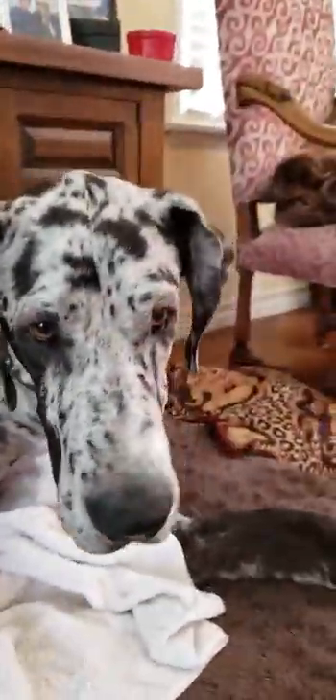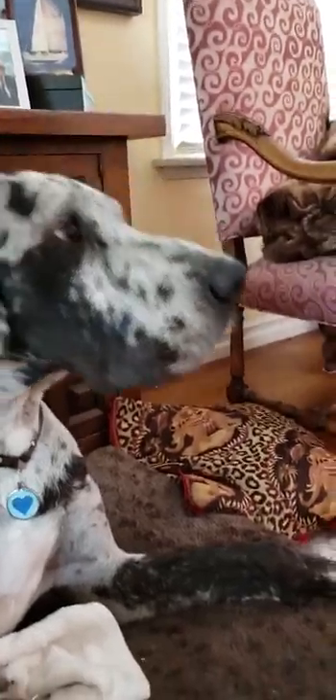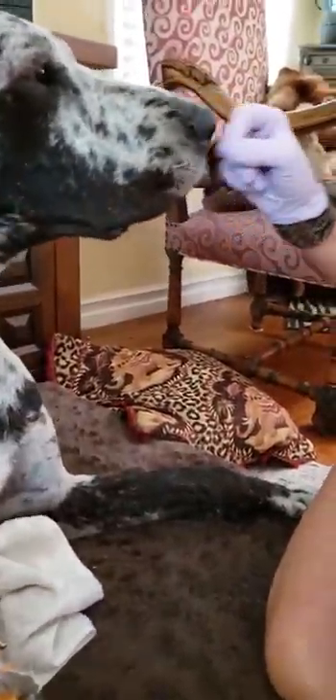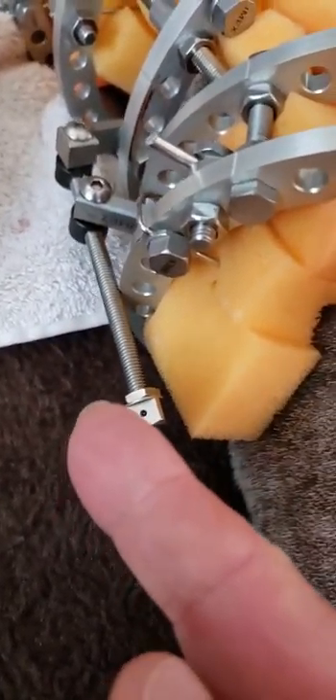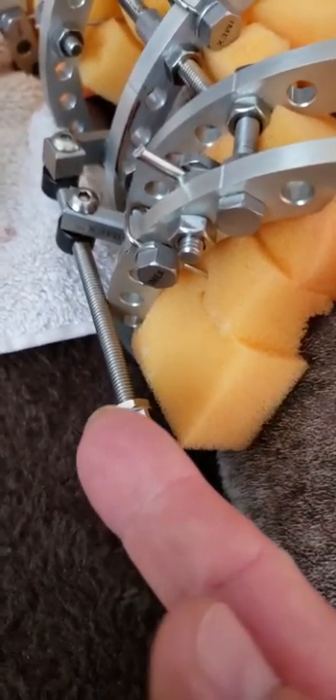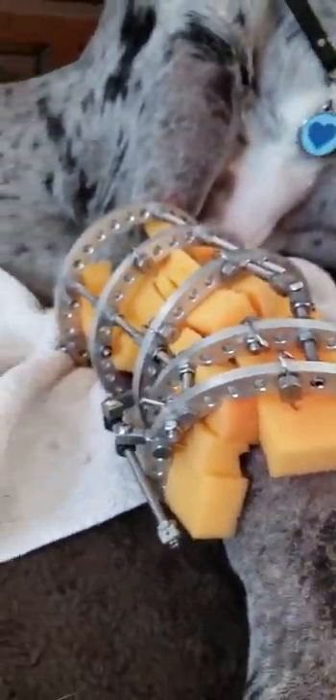This adjuster screw — careful, big boy, stay here, you're okay. He's been very good, laid there the whole time. You can see here how this side has one dot and this side has two dots — they're drilled holes so we know which is facing up. We do one full crank until that dot comes back around clockwise, and when it comes back around you've gone half a millimeter. We're doing one millimeter a day.